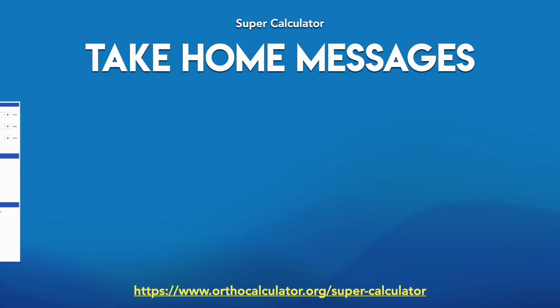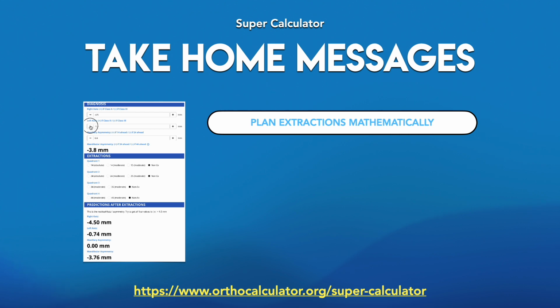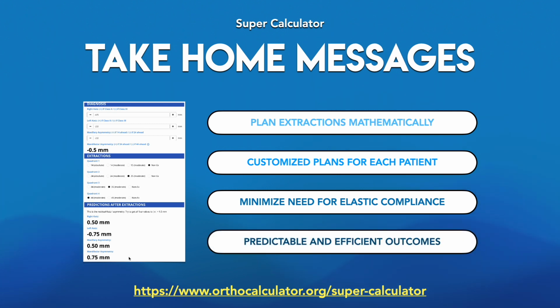In conclusion, Supercalculator is a tool to help orthodontists plan extraction patterns mathematically. It allows us to get away from conventional extraction patterns and customize our plans to our patients' unique needs. By extracting the right teeth, we minimize our reliance on patient compliance with their elastics, leading to predictable and efficient treatment outcomes.